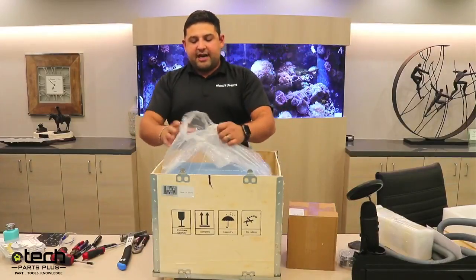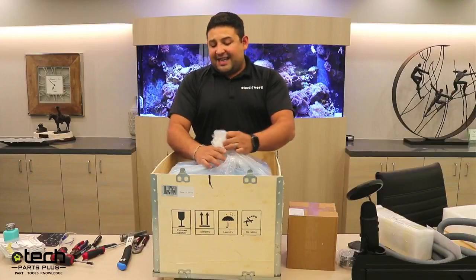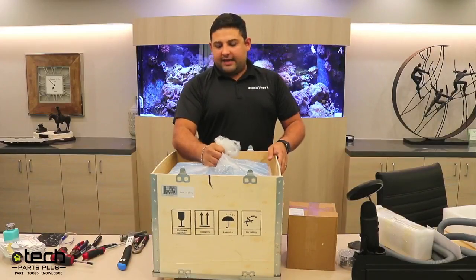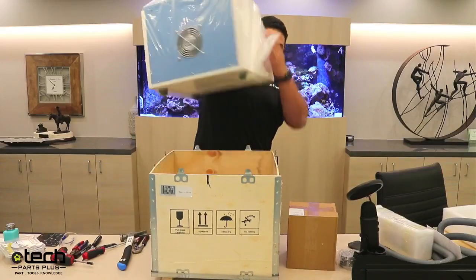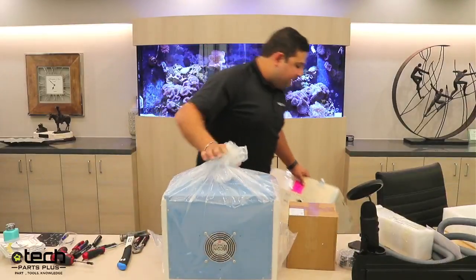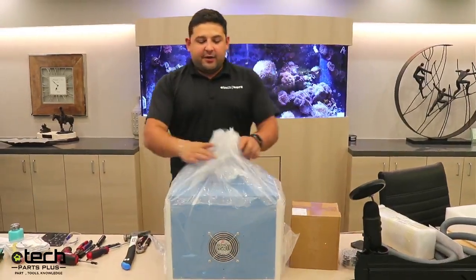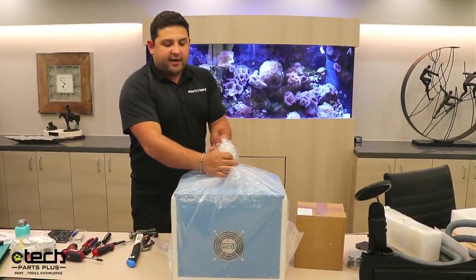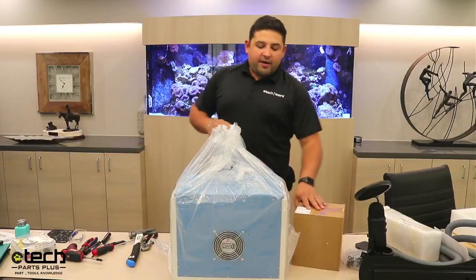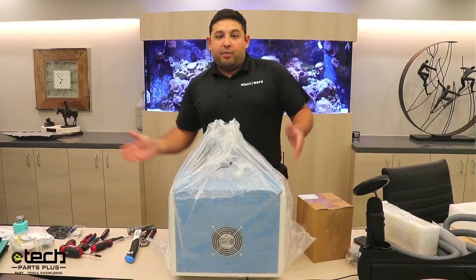To take the machine out of the box, grab it by the center with all the plastic bag — it's pretty strong. Lift it up, move the crate over, and put the machine back down. If you can't lift the machine by yourself, have two people — one on each side — grab the center and lift. What you want to avoid is any big drop of the machine or a bump.